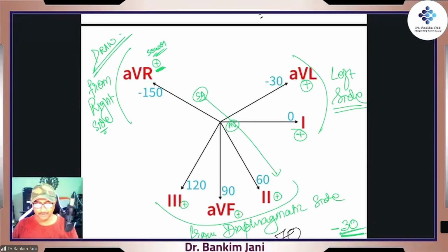Exactly. So this thing is clear. And as you start watching the ECG now, there will be an aha moment. To get the proper ECG, we make AVR negative? We don't have to make AVR negative. My dear, AVR would automatically appear negative. AVR will be receiving the signals from the AVR perspective. Here is the SA node, here is the AV node, right? See the signals, everyone is going away.